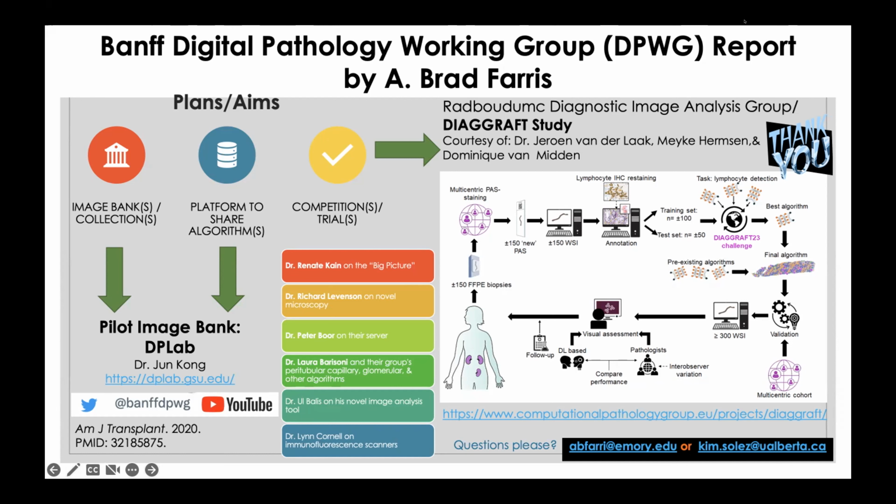and that's going to be really good. And then they'll get the groups to scan those too. So it'll involve different groups doing different stains, different scanners. And then there'll be a challenge, just like the breast cancer challenge, which has been done. It'll allow people to test their algorithms, and pathologists will be involved in scoring some of those too, I believe, to look at inter-observer variations and things like that. So Jesper has interacted with them a lot, I think, and he's on now too. So thanks for joining, and I appreciate that.